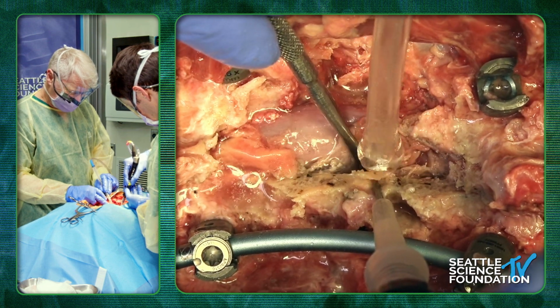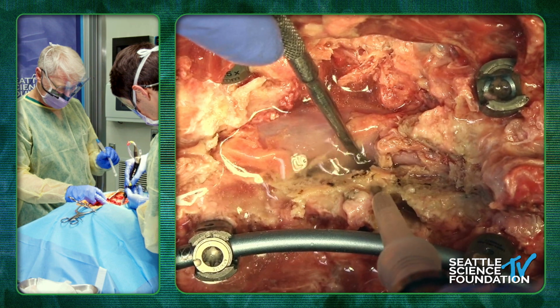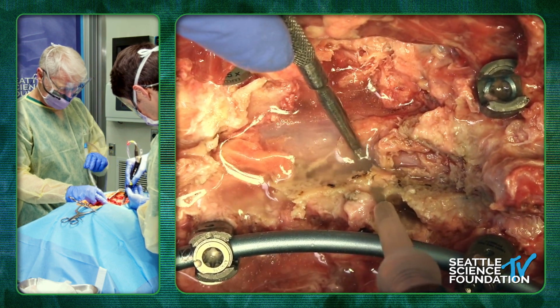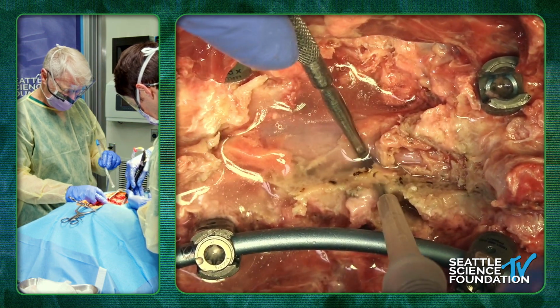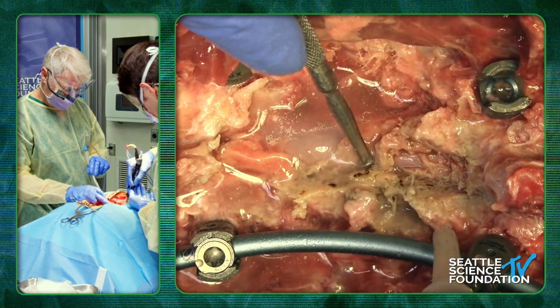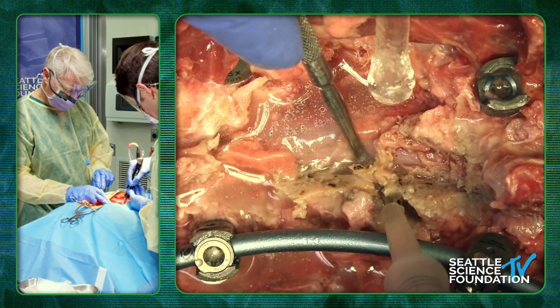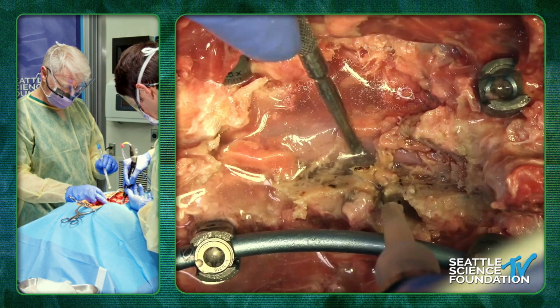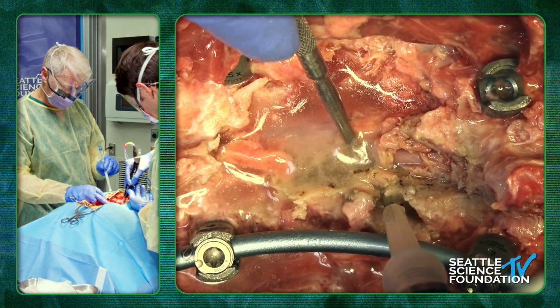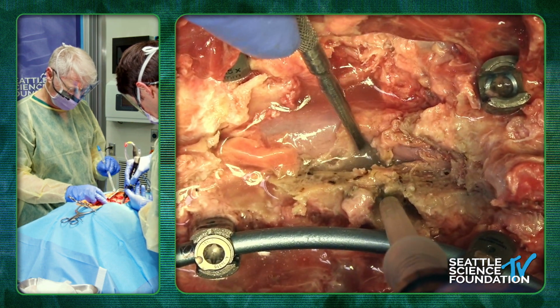Okay, so the superior attachment of the bone, the proximal attachment of the bone to the pedicle, will be the superior facet. If you just come right above the pedicle, you're going to separate the superior facet all the way from the pedicle, and that will release. If the superior facet comes out, all the ligamentum flavum attaches and comes out, and you get a very significant release on the posterior column.